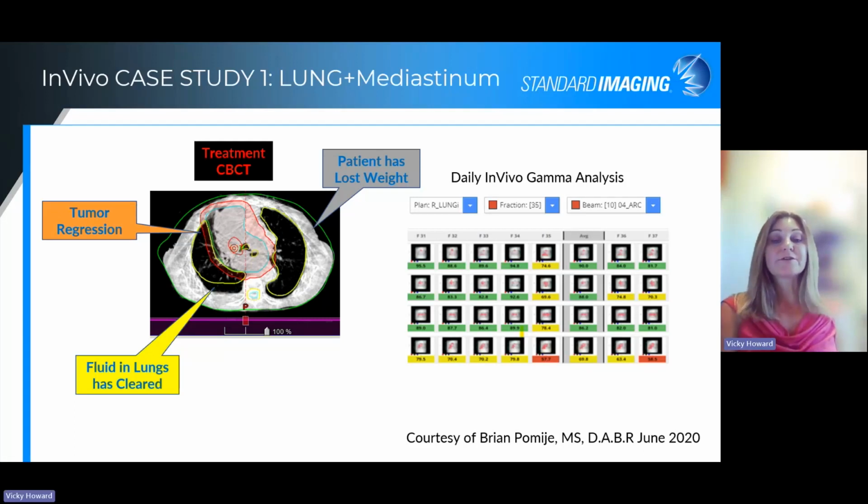So really, to truly understand the quantitative power of Adaptivo, I'm going to quickly present 2 real-life cases where Adaptivo was helpful in determining the need for adaptive therapy measures.